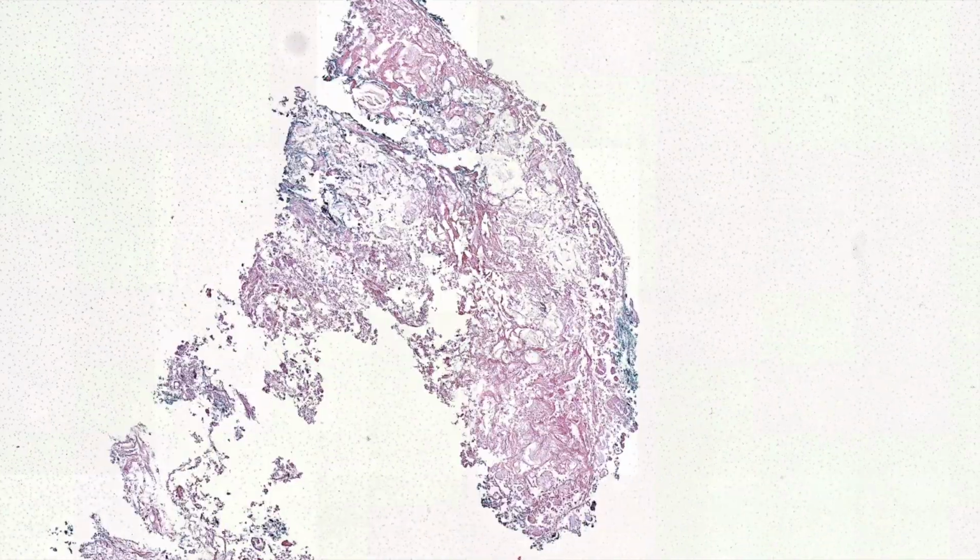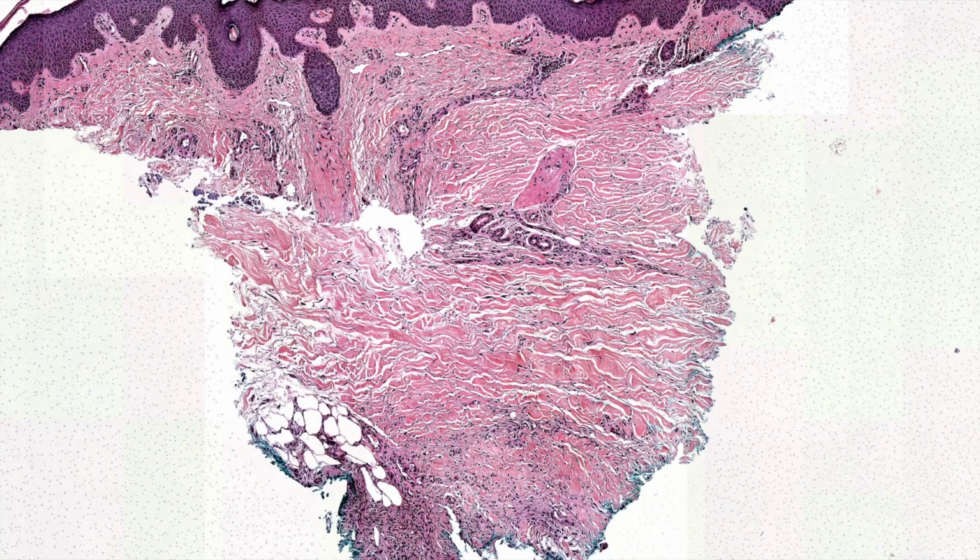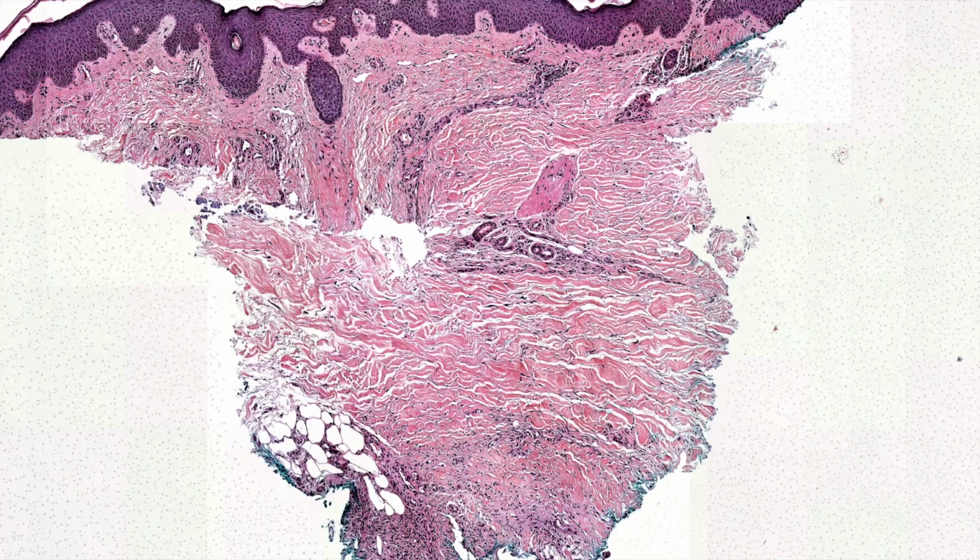All right. And if there's a lot of neutrophilic inflammation and this kind of pattern, I believe alpha 1 antitrypsin panniculitis, which is something I don't think I've ever actually diagnosed in real life. It can have some similarity to this, but my understanding, if I recall correctly, is that it usually has more neutrophilic infiltrate. Does anyone know more about that than me, or know if that's right? I meant to look that up and I didn't.